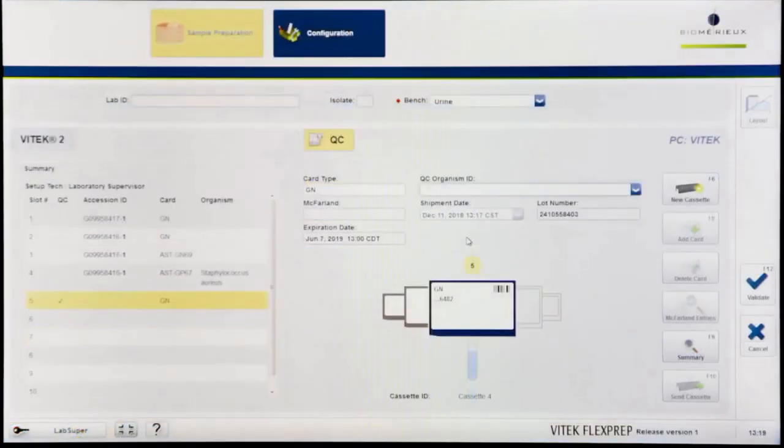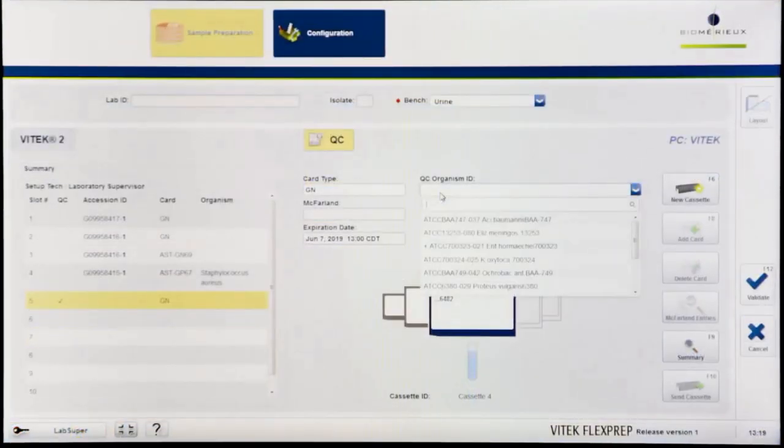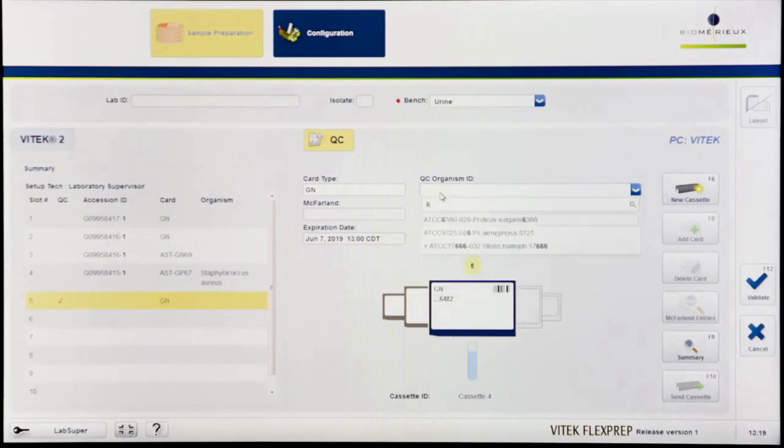Click the QC Organism ID field. Select the correct QC Organism ID for the card from the Organism drop-down menu.